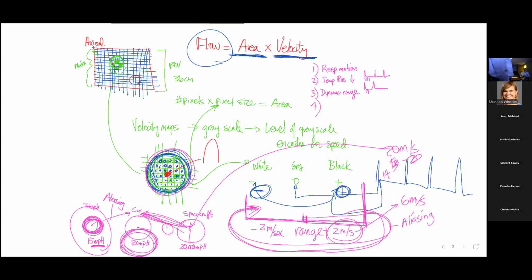There's a fourth thing that we have to think about. And, I drew for you that whole phase encode thing. Remember? So we have one that's not sensitive to motion and one that is. But that one that is only in one direction. Right?